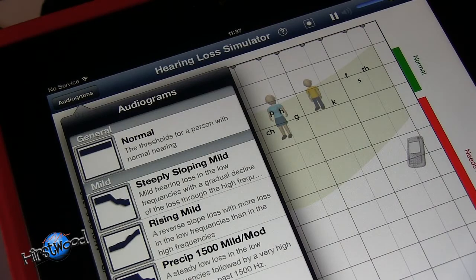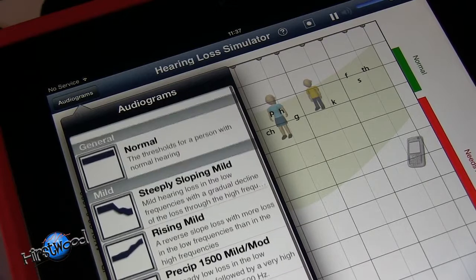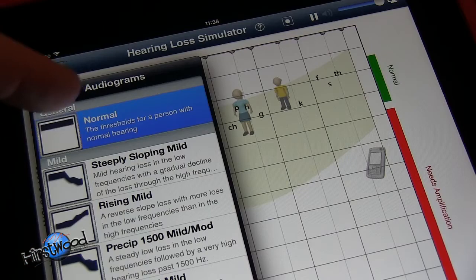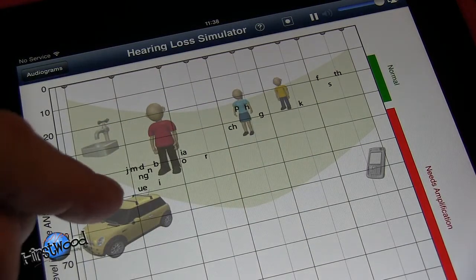Just tap on that and then we can scroll through these. Let's have a look - let's go somewhere up here and let's just do normal hearing first of all. Then tap anywhere out, and then let's have a listen to a car.